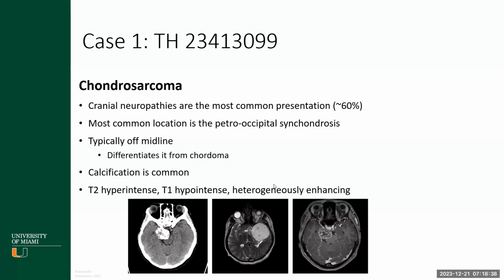So right, the notochord is a midline structure, and it's going to give rise to multiple spinal structures, for example, most specifically the nucleus pulposus of the spine, so you're going to have it in the midline, right? Very good. And then these are just the enhancing characteristics on the imaging below.